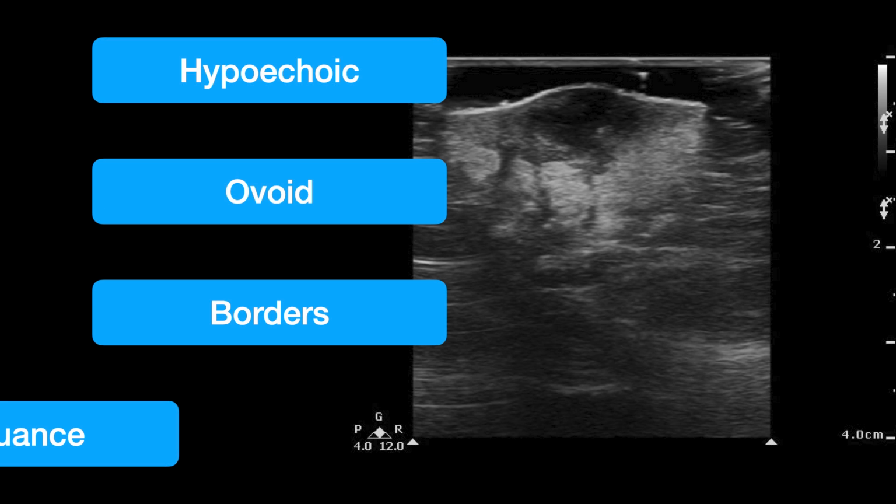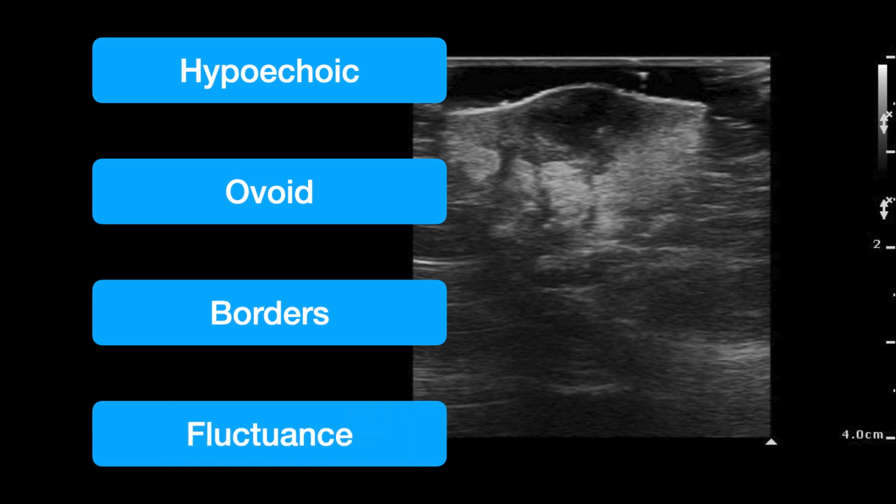And then the final characteristic of an abscess is this idea of sonographic fluctuance. That is when you apply a small amount of probe pressure, oftentimes you'll see movement inside that core that is not consistent with just normal displacement of tissues. If you were to put your ultrasound probe on normal skin and compress it, you'll see that the architecture of that soft tissue is decently preserved all the way through the compression. It may just be squashed or flattened out a little bit, but the architecture stays the same. What you see with the abscess is, because it's all liquefied and there's no architecture, when you apply some pressure, it's just going to move out of the way, right? You'll see that movement, that sonographic fluctuance.